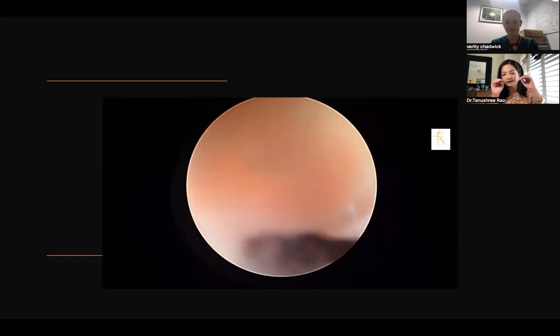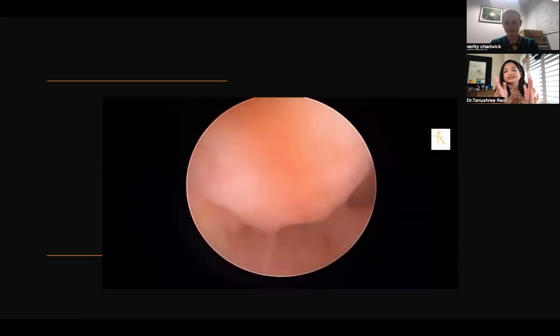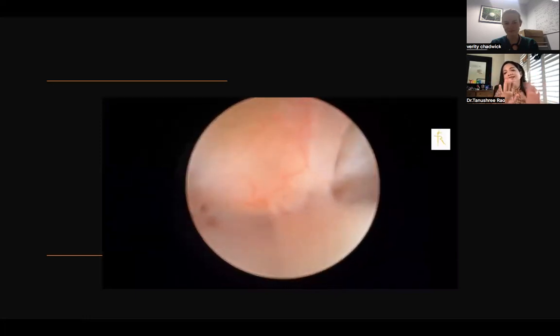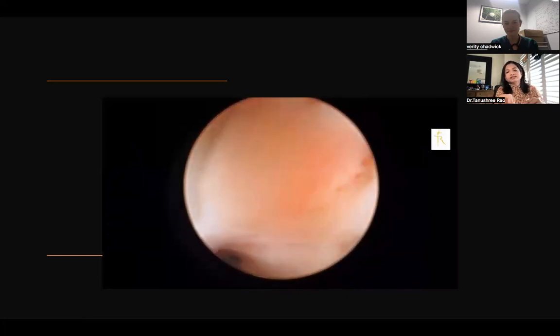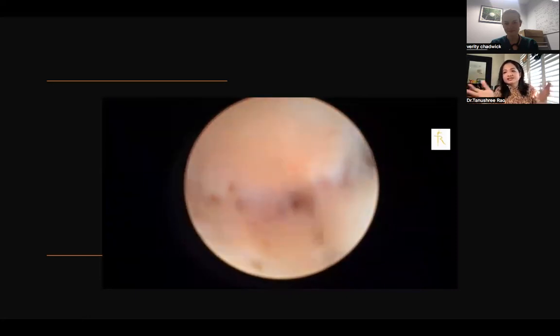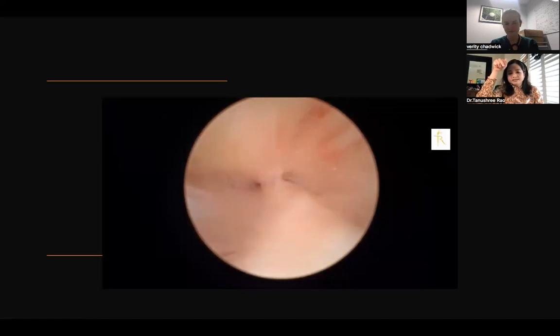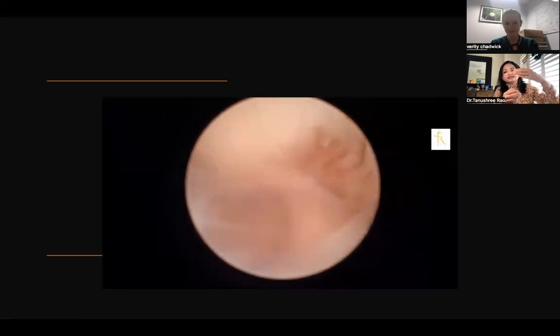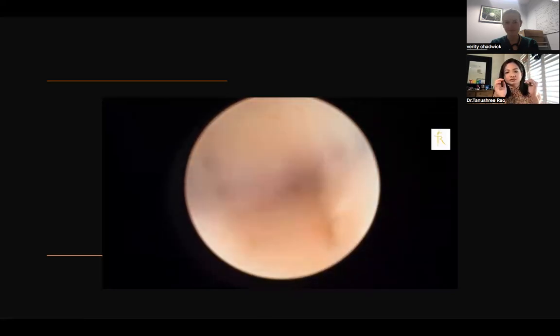So we're going into the vagina. It's really easy. Sometimes, when I was young, I would think, would all the water leak out? But actually, really not. Nothing's to be done. You just insert the hysteroscope and the vagina just distends with the water. I go straight down posteriorly and then bring the hysteroscope on top. During that process, I tend to see the cervix. So now I've seen the cervix and we've gone inside.